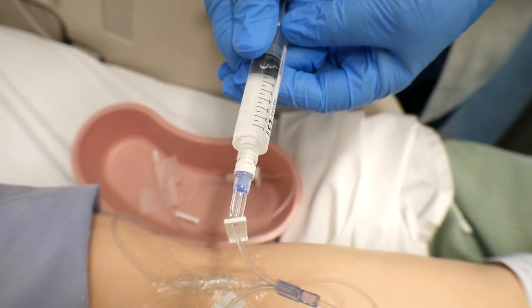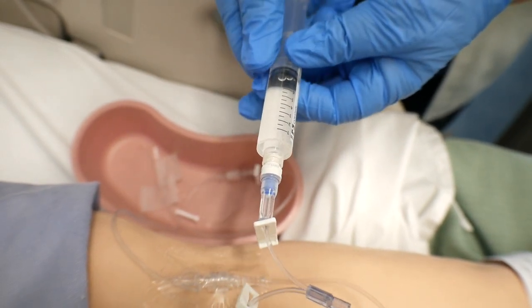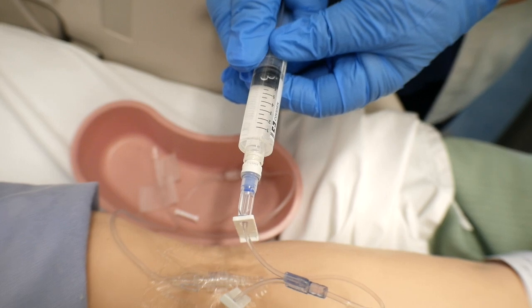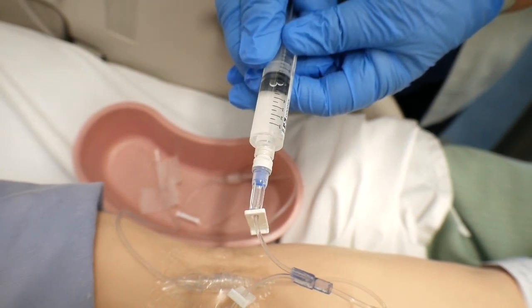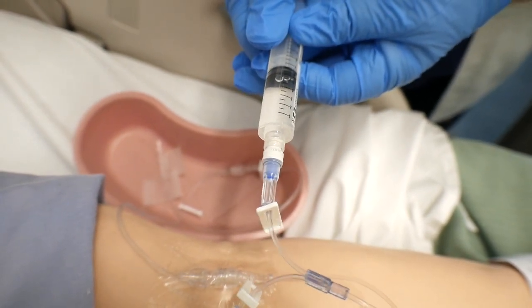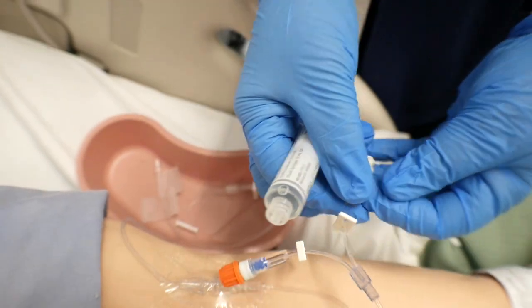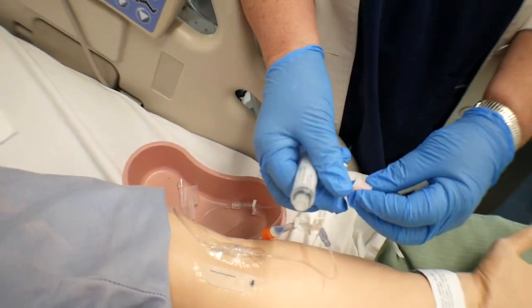So it just goes a little bit slower, and then I can evenly flush the next 2 milliliters slowly, just to make sure that all the medicine goes in. And then this will be patent for the next time. Okay. So then I'm going to go ahead and cap this with the orange cap.